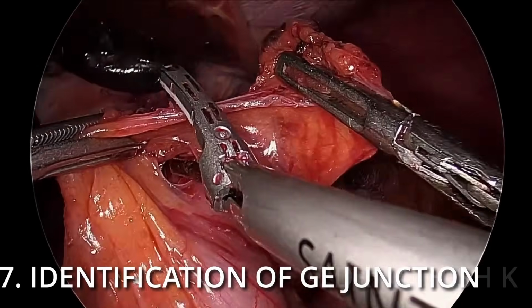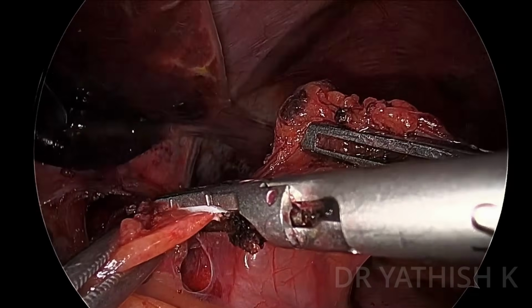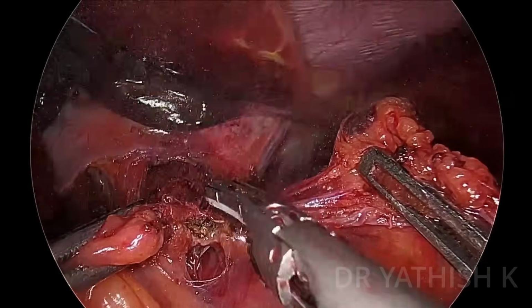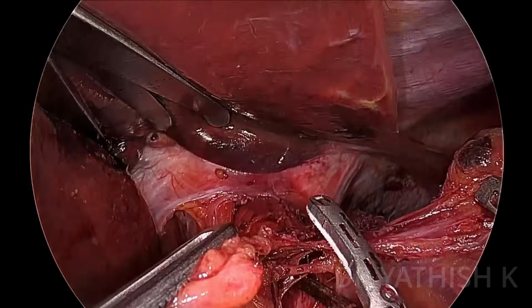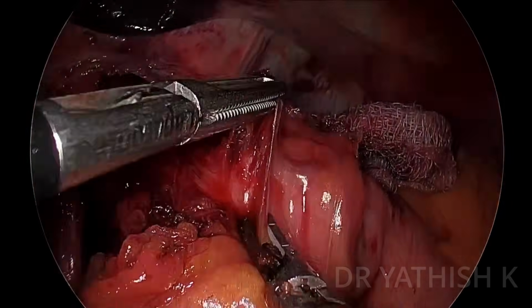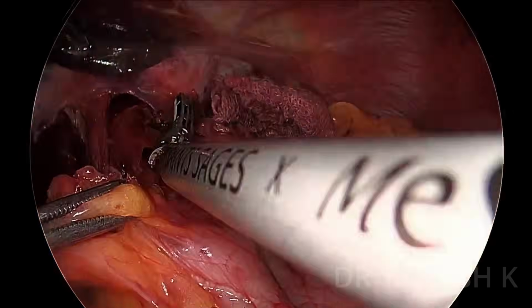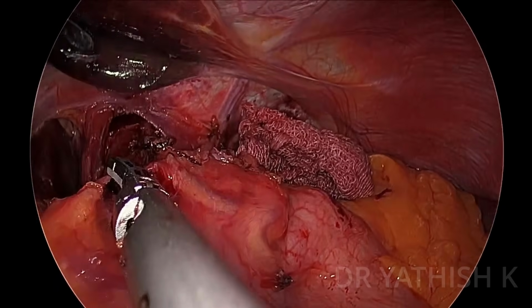Once you have mobilized your anterior vagus, the next step is to identify the gastroesophageal junction. How do you identify it? These are the fat called Belsey's pad of fat. So I'm just mobilizing the Belsey's pad of fat, where my assistant is pulling one end of the fat to the other side, and I'm pulling it out with my other hand. So see, now that I've mobilized the Belsey's pad of fat, I've identified the GE junction.